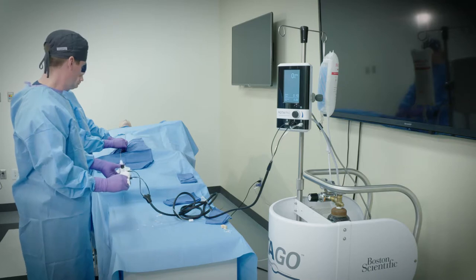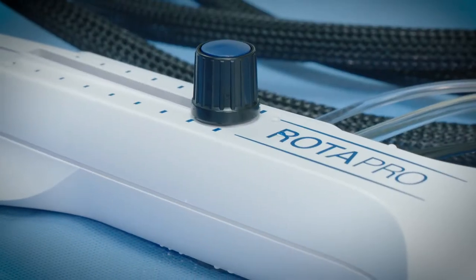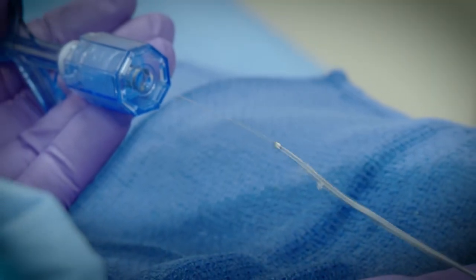When the burr is one to two centimeters proximal to the lesion, retract the advancer knob fully. This will prevent the burr from darting forward when activated.